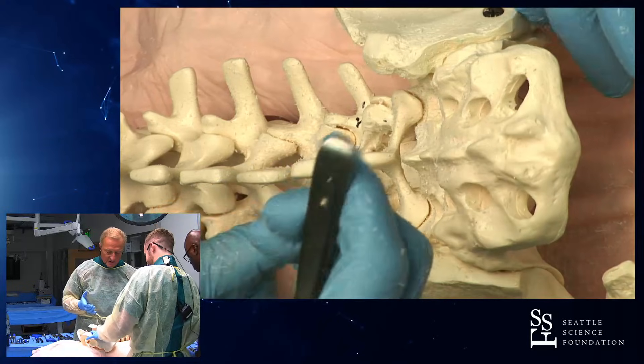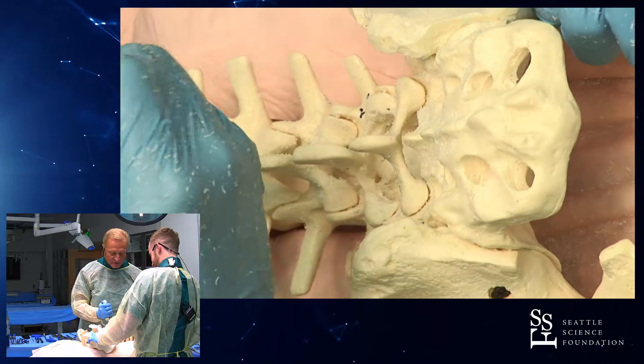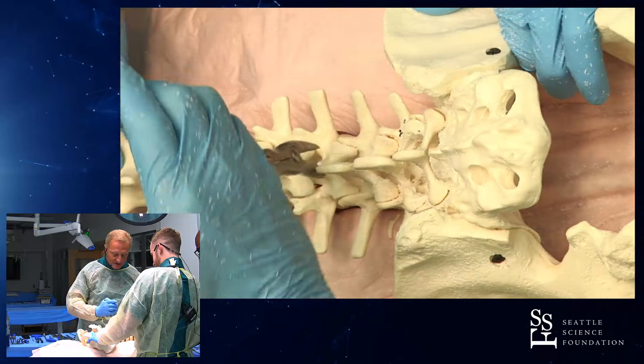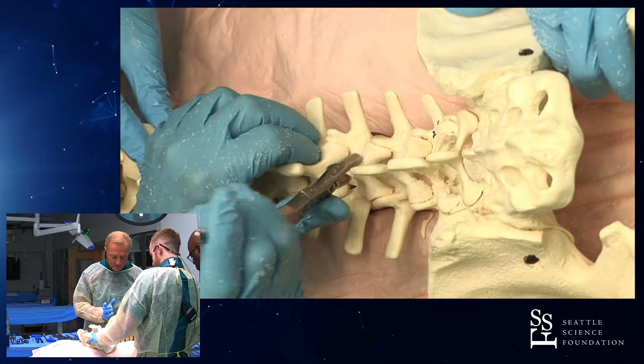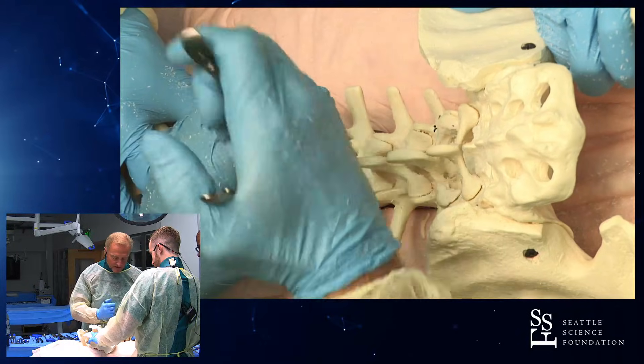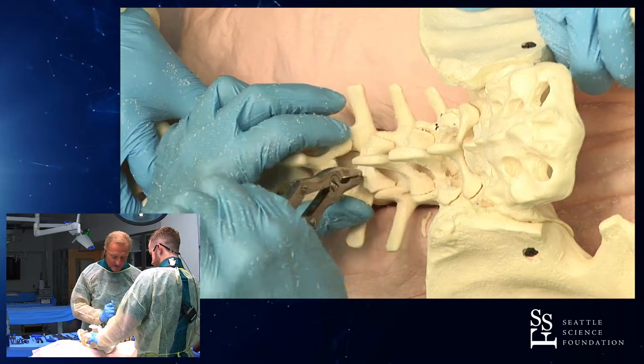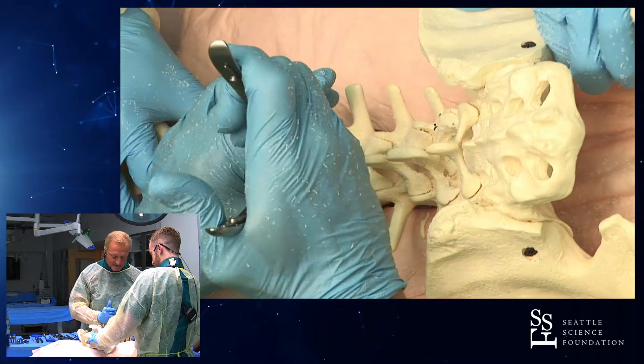So U-shaped cuts, J-shaped cuts — the ligaments stay intact, very effective. Let's say we have to do — and we're going to do this in a cadaver in a second — a full laminectomy, for instance, for an osteotomy. Here we have a great cut: the Texas T-cut, also Tennessee T-cut, but in honor of Jack Ziegler, I call that the Texas T-cut.